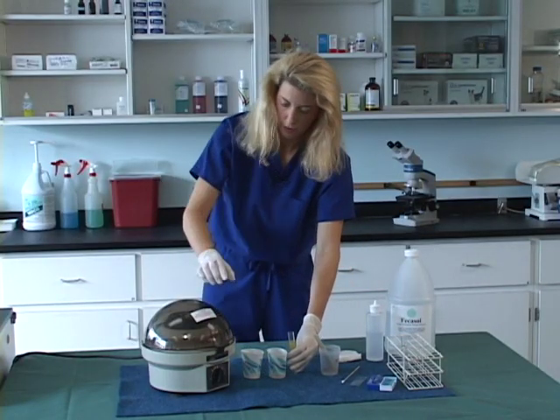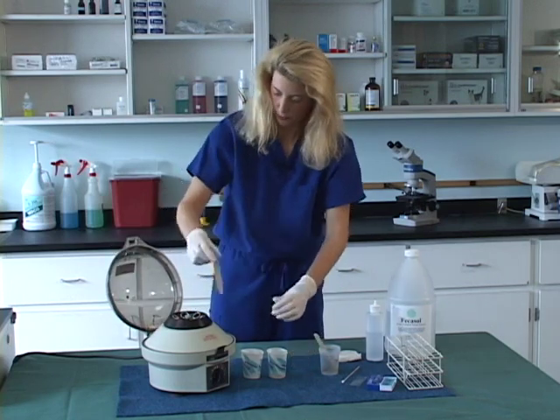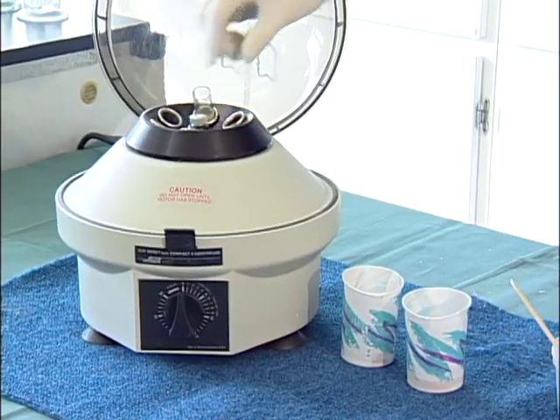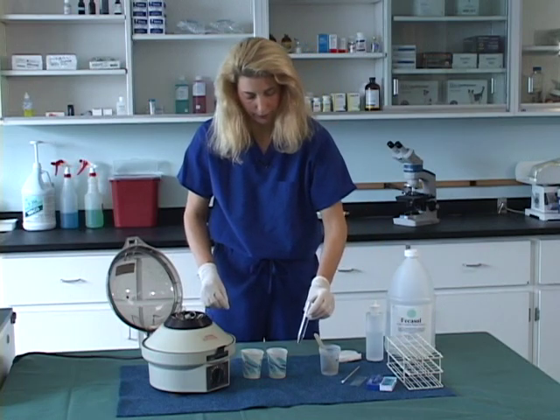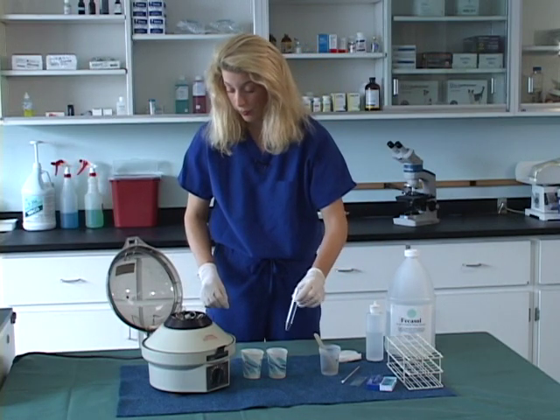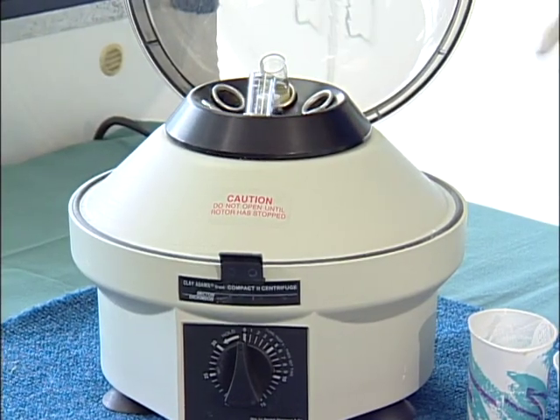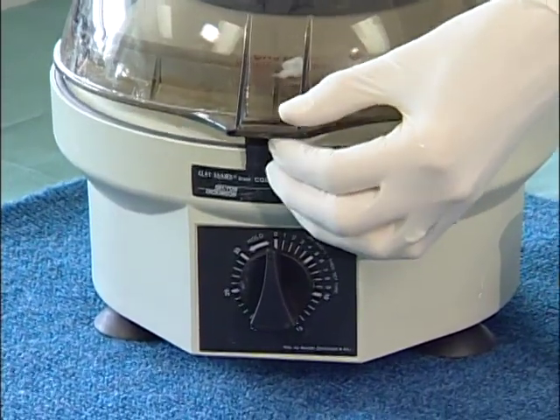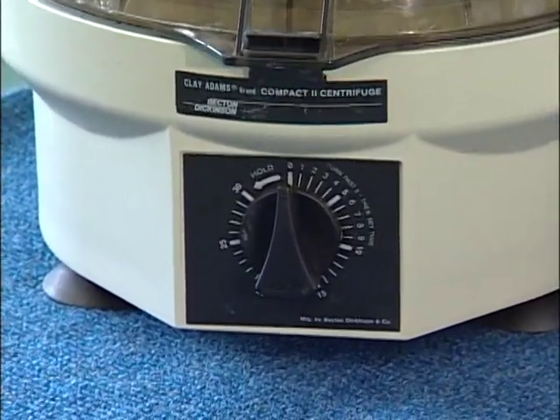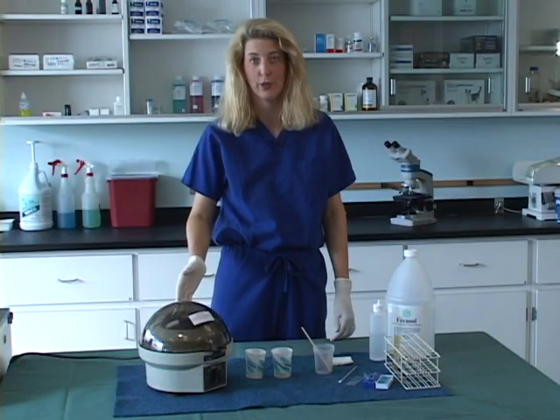Now we are going to take our centrifuge and spin this supernatant. Place it into the centrifuge, then take our balance tube and place it into the centrifuge opposite from the fecal solution tube. We are going to spin this at 1200 RPMs for 5 minutes. This is a fixed head centrifuge.